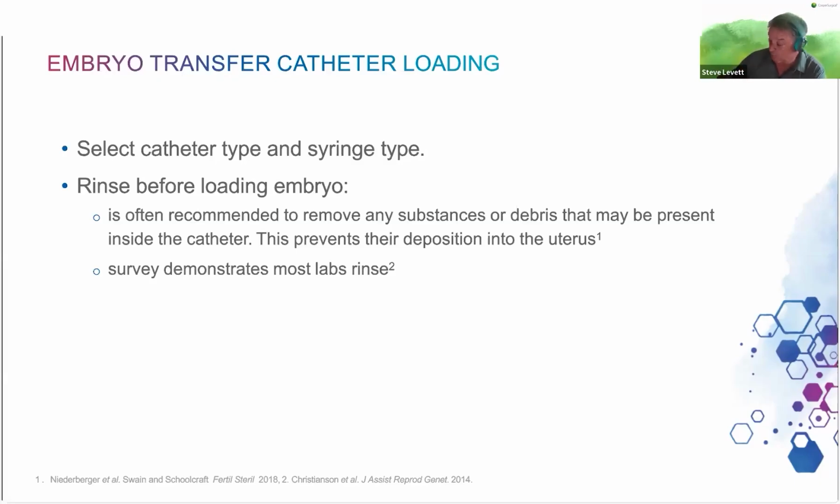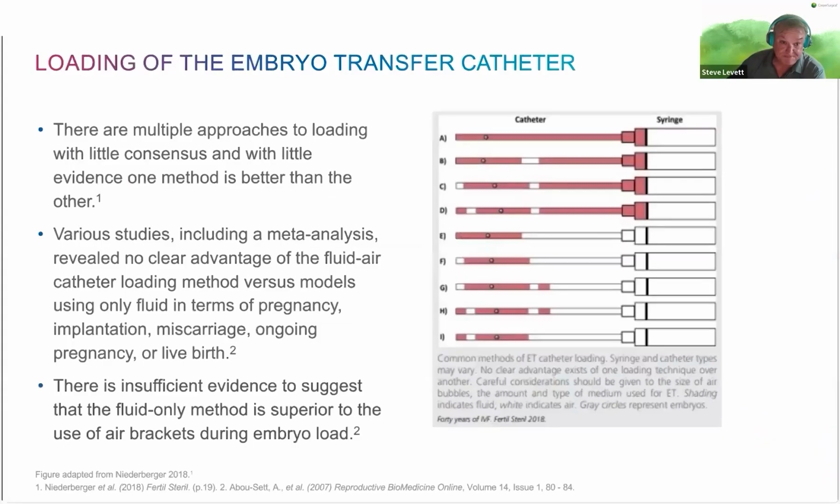There is no need to warm embryo transfer catheters beforehand. As soon as you open the packaging, the temperature is lost, and there's a risk that you'll introduce VOCs into the lab. So flushing the catheter through is an important factor to consider.